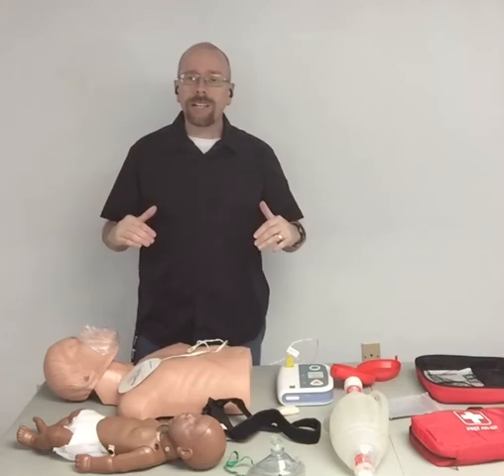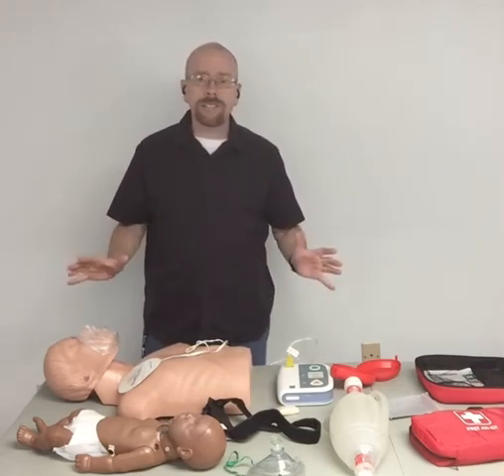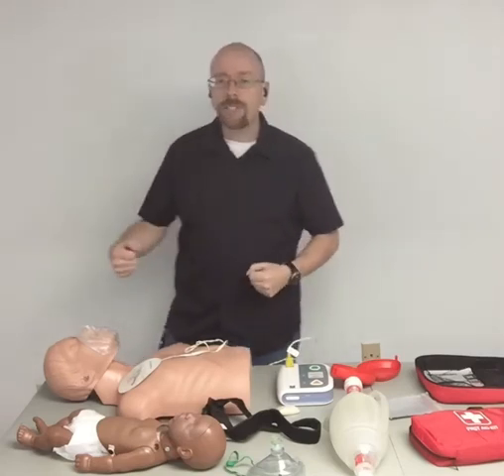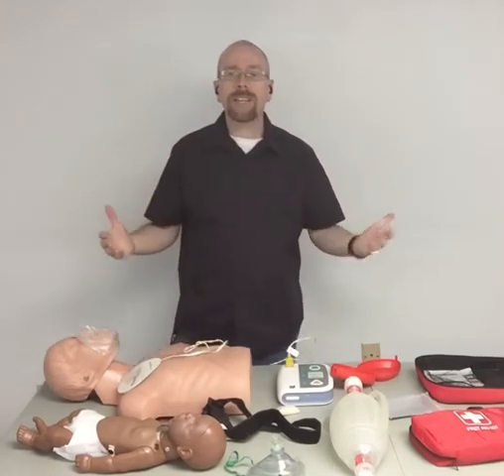So just backtracking a little bit, does the defib jumpstart the heart? No, it doesn't. You may have thought that in the past when you've seen it on TV. They used to take the paddles and put the paddles on the chest. Boom, the body jumps. It's like a jump start.